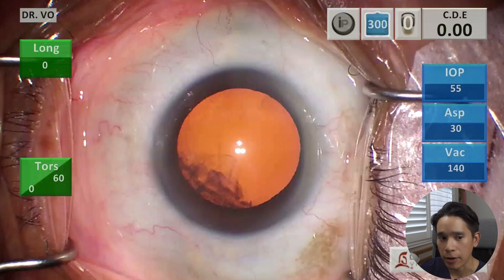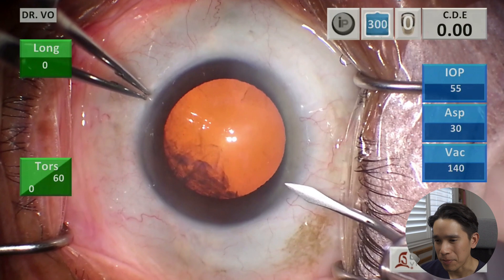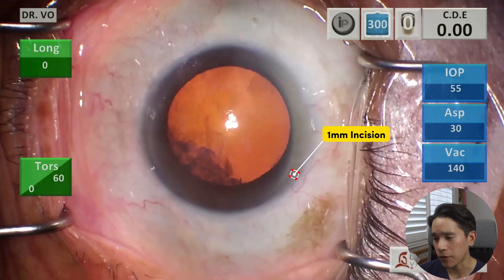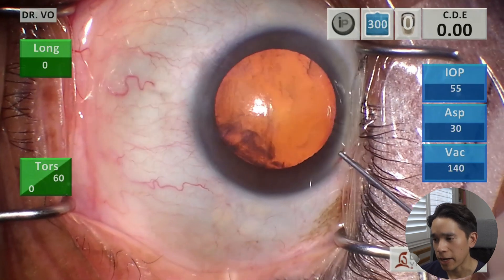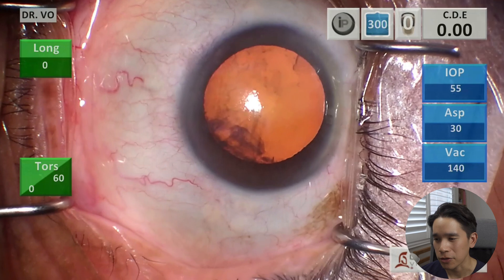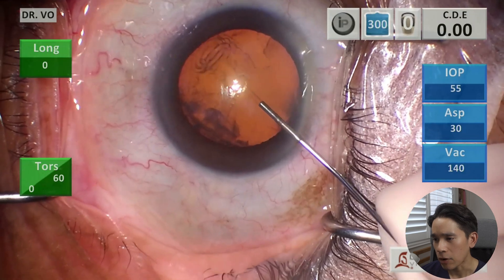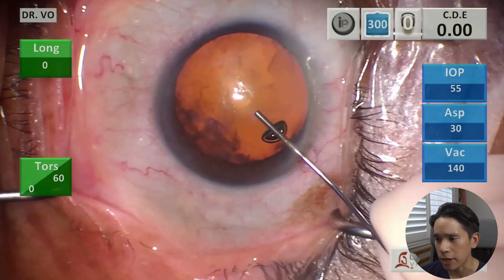So I have the case here and we'll go ahead and start the video. This is a routine cataract surgery. Most surgeries you can expect to take about 10 minutes or so. Here we are making the first incision. This incision is only about one millimeter in width, so a very, very thin incision. This is for my off hand, which is my right hand, my non-dominant hand. Here I'm just injecting some local anesthesia inside the eye. A lot of patients are concerned about whether they're going to feel pain during the surgery, and for most patients, they don't feel any pain at all. Now I'm injecting some jelly-like material to help inflate and pressurize the eye while we operate.